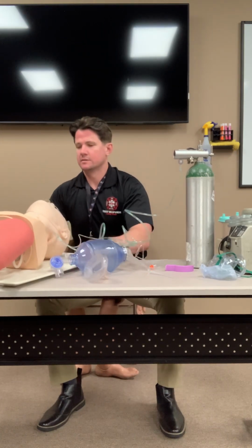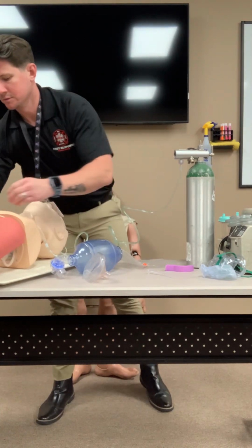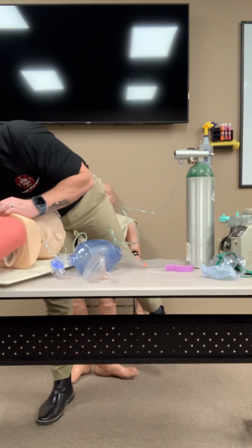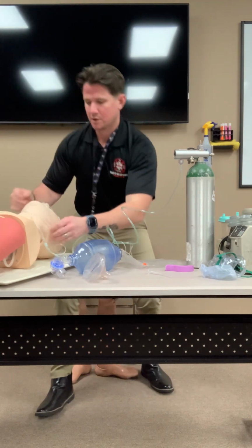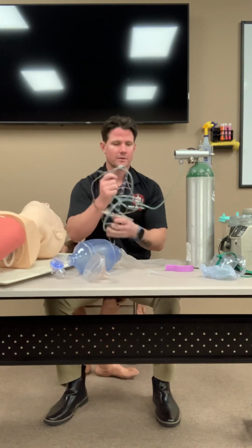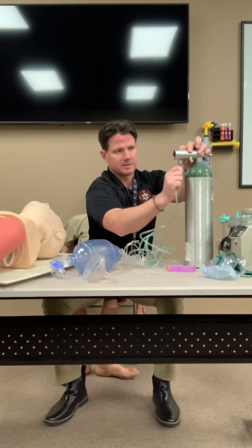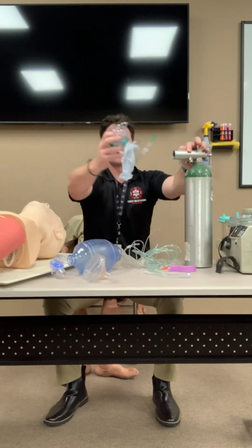Once you've done that, if prompted to switch over to a non-rebreather, we're going to go ahead and take this off. You can shut down your O2, put it back to 0, take this off, and get our non-rebreather.